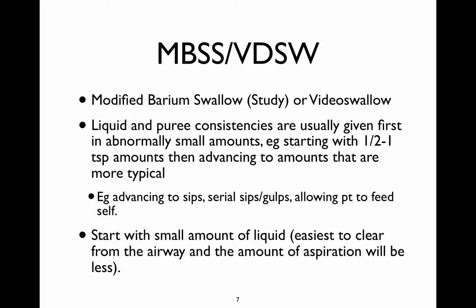Okay, a few words about your well-known MBSS or VDSW. Those initials stand for Modified Barium Swallow. Sometimes there's a second S, study, or a video swallow. Again, same PO substances that you would expect under any circumstances.